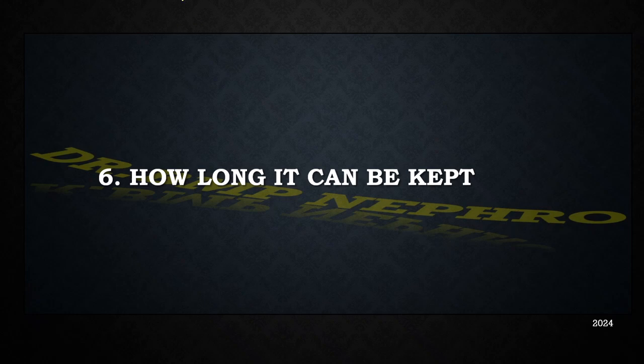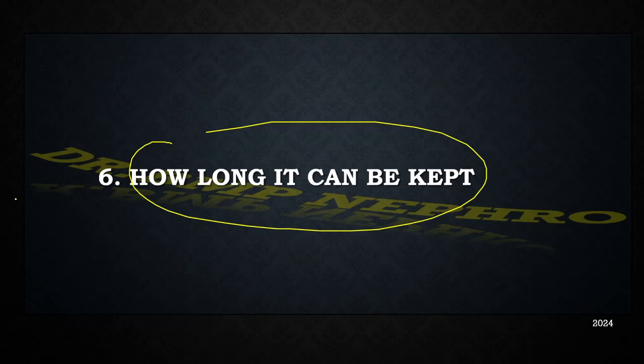How long can it be kept? The most common question from the attender. How long can it be kept? There is no specific time limit, up to 2 years, 3 years, 4 years, 5 years, as long as there is no issue of infection, as long as the patient tolerates it, as long as the flow is good.